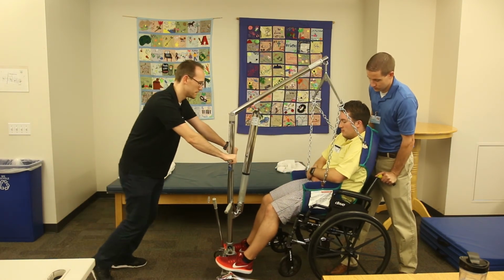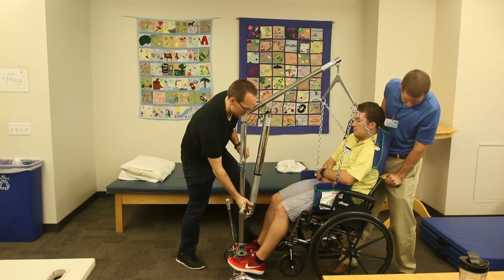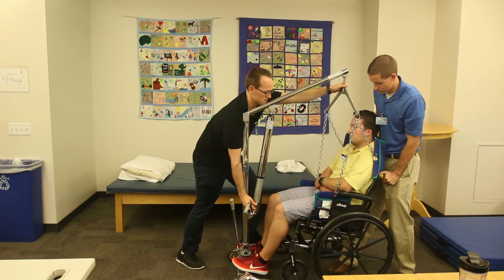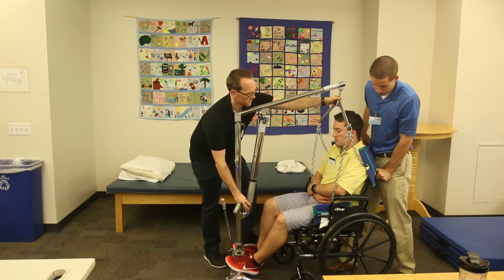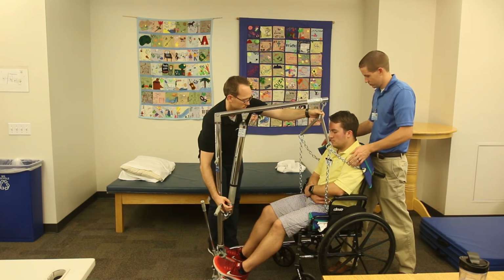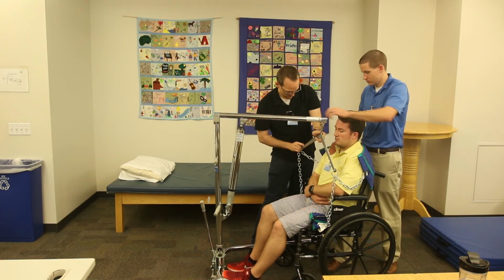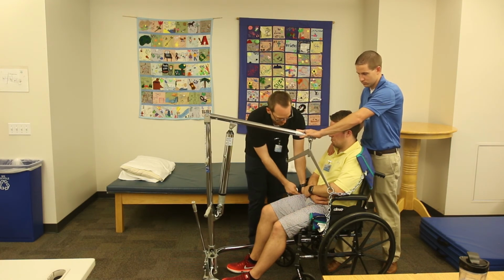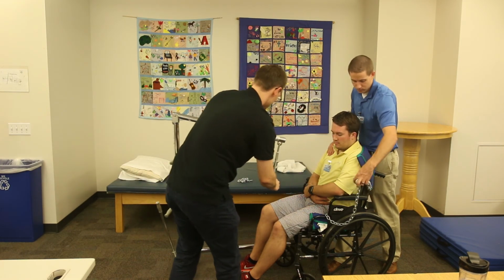All right. Are you ready, Dylan? Yeah. I'm gonna slowly lower you. I'm gonna watch out for this so it doesn't get you in the head. I think we're in. Yep. All right. And then just make sure to hold his upper body, make sure he's good. I'll help take this off, move it back. That's pretty smooth. I like it. I'll move this Hoyer away.